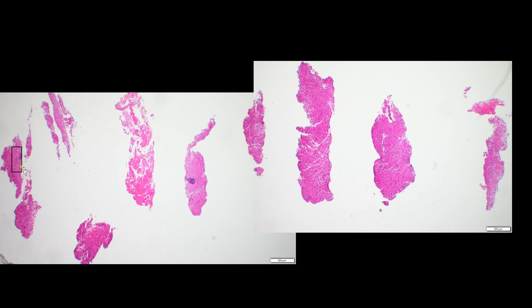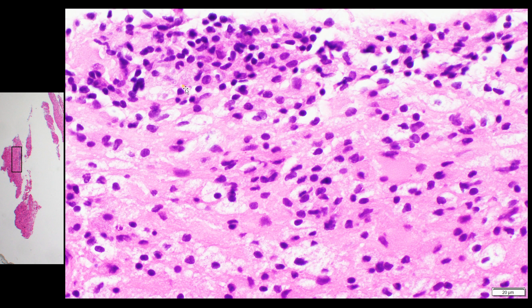Coming back to our biopsy core and looking at another location, we can again see small, round, uniform, monomorphic hyperchromatic cells — which are lymphocytes — so we've got a little more inflammation. There are also some cells that have this cleared-out cytoplasm with a pretty round nucleus — these are macrophages. Some general surgical pathologists might say that this appearance — a round nucleus with cleared-out cytoplasm — looks like oligodendroglial cells and the typical fried egg appearance.